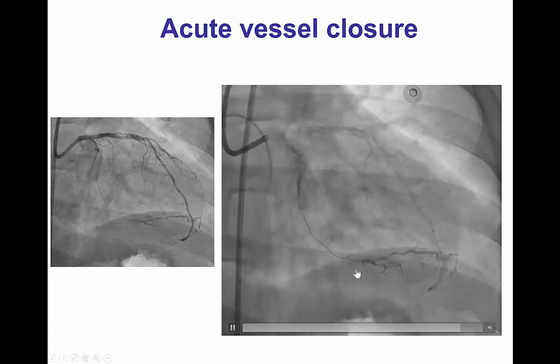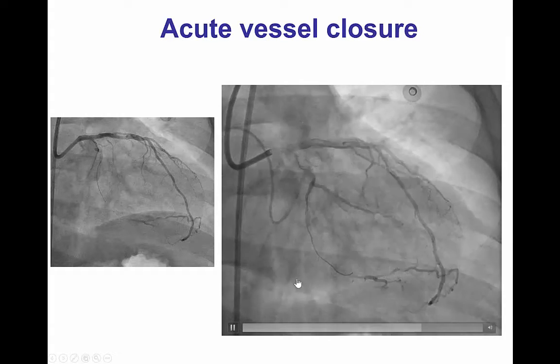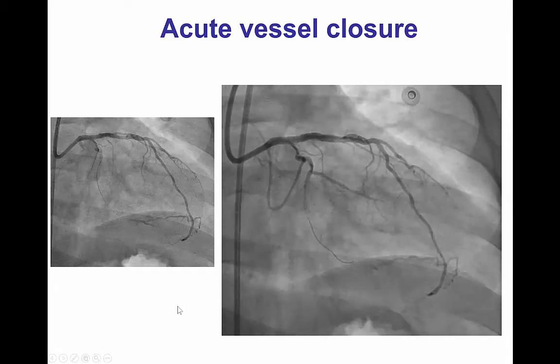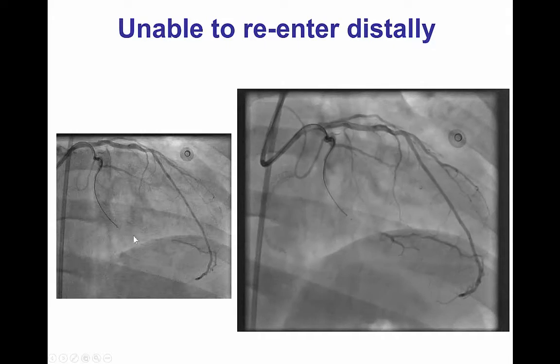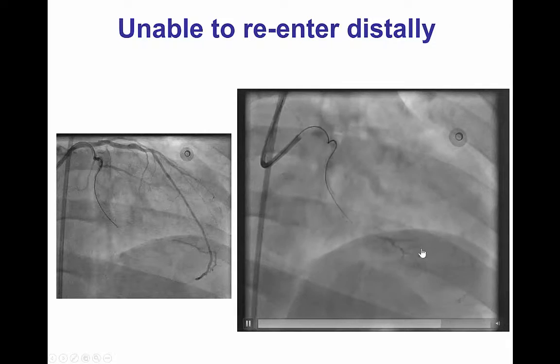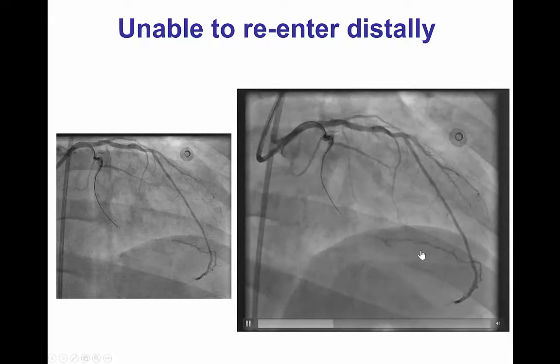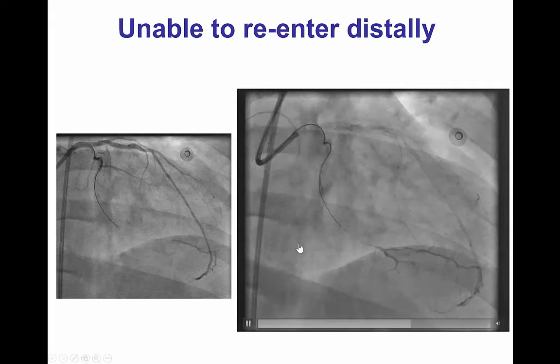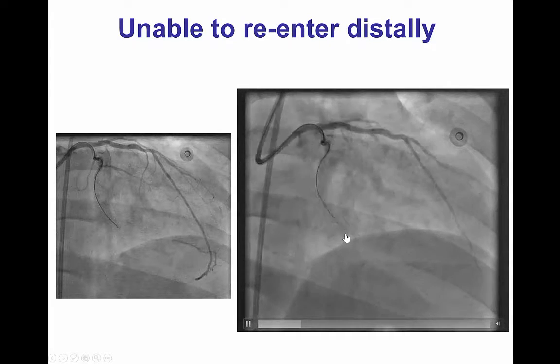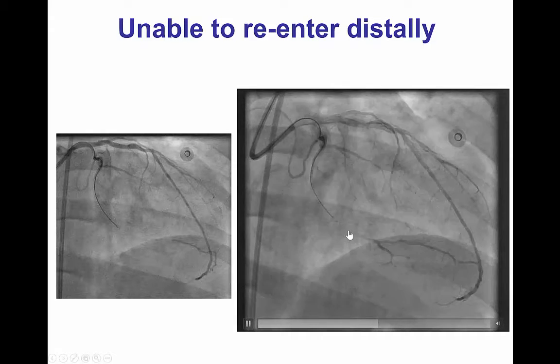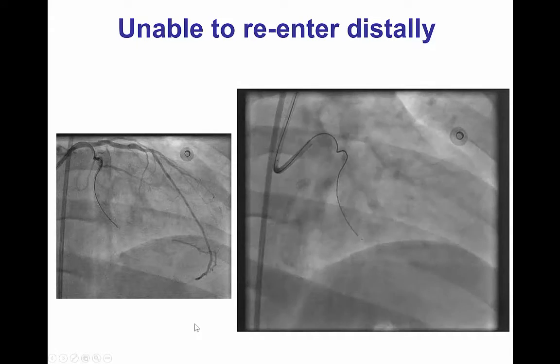The patient at this point started having chest discomfort and electrocardiographic changes. We did multiple attempts to advance a wire into the true lumen of the second obtuse marginal branch. However, we were unable to do so even when we used an antegrade stingray balloon and guidewire — we could not get re-entry into the distal true lumen.